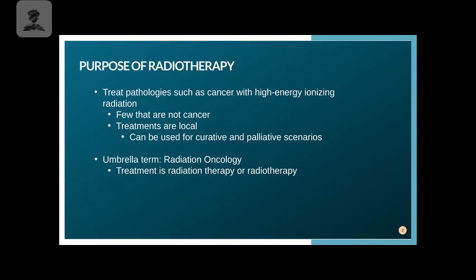They could be in very challenging spots where they might cause damage to other structures. So they can come to radiation therapy, and we can do a treatment called a whole brain. We can treat the whole brain, or we can add some extra boosts of radiation to some of the larger tumors. What that'll do is help shrink the size of the tumors.